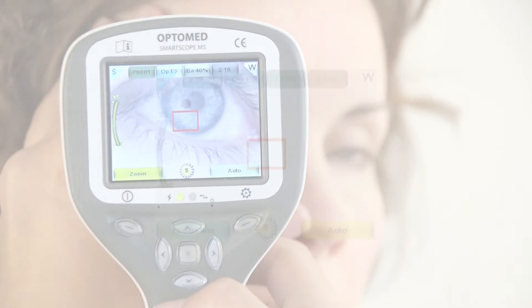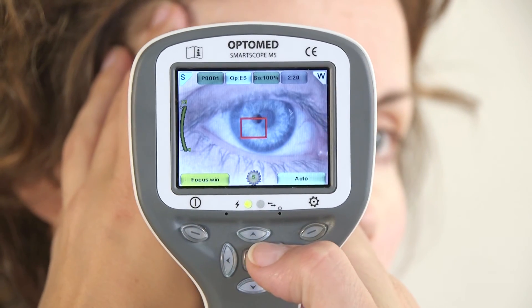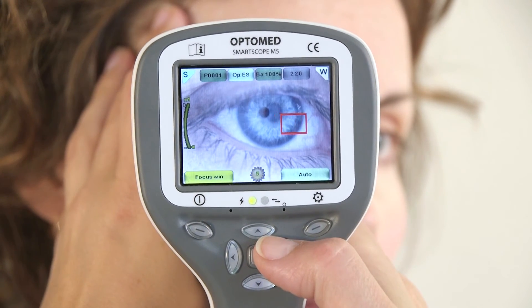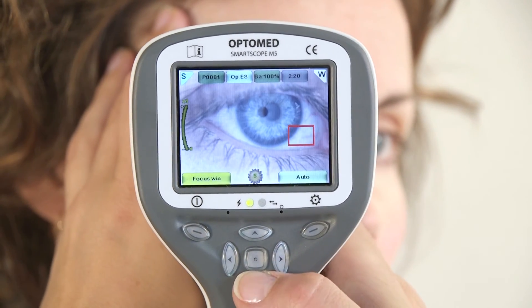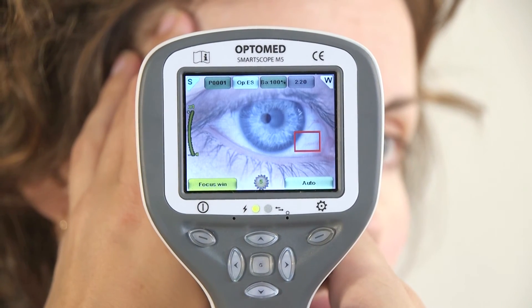The icon on the top left of the screen will indicate the zoom level. The focus window is activated by pressing the left soft key. The focus window feature helps the user to find the right focus target in the image. Move the red focus window box by using the arrow keys. Autofocus will focus on features inside the window.